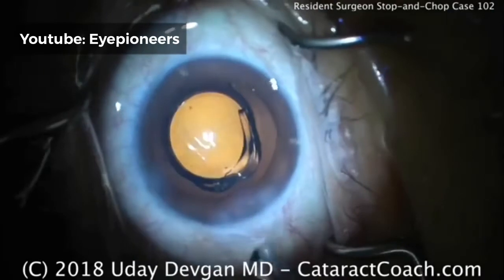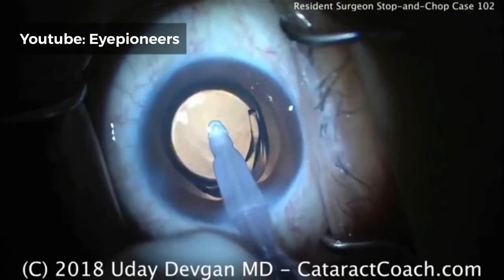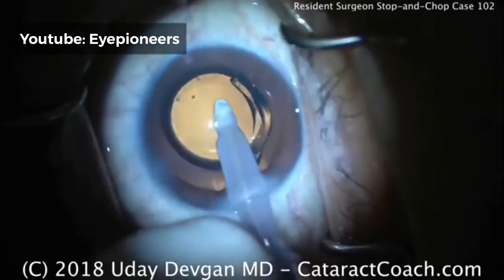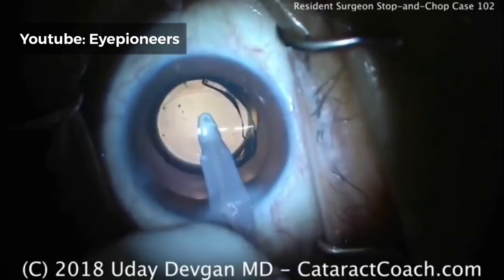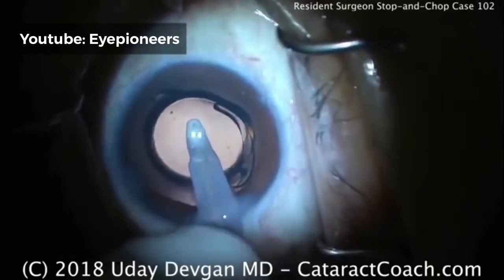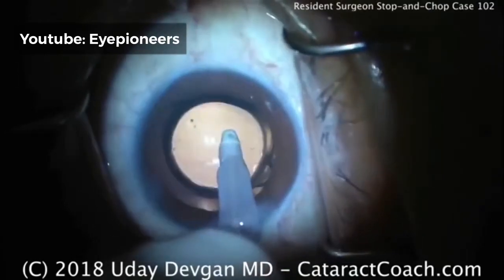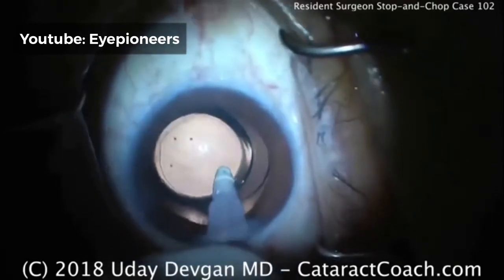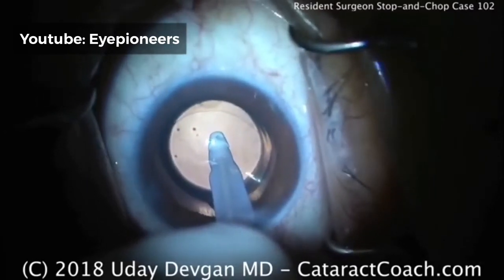Now let's position the lens underneath the capsulorhexis. I'd rotate the lens a little bit more just to ensure the haptics open up fully in the capsular bag. Here's the IA probe — put the probe in the eye and you can help push the IOL optic posteriorly. We need to wait for that last haptic to open up; don't leave the lens like this. Sometimes it's tougher if cold water from the IA probe enters the eye, because acrylic lenses don't unfold as quickly when they're cold. Leave the eye full of viscoelastic and open both arms under viscoelastic fill using the chopper prior to putting the IA probe in. That lens is opened up beautifully — completely underneath the capsulorhexis.